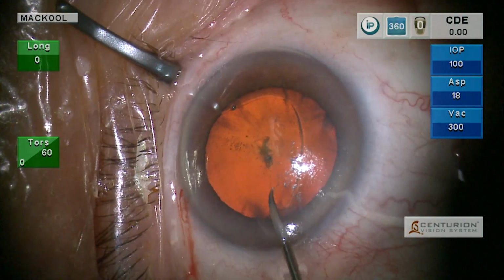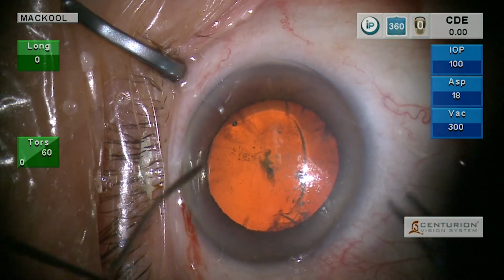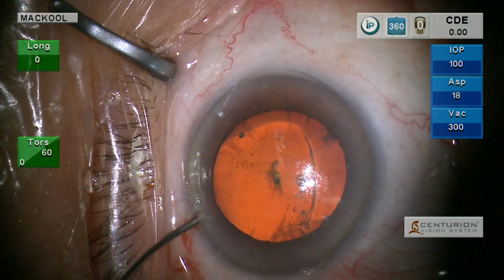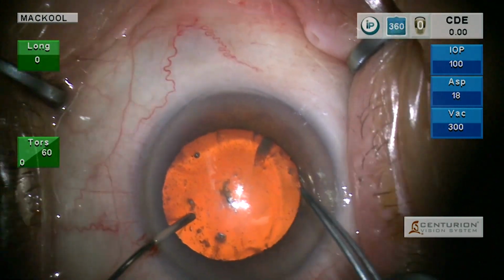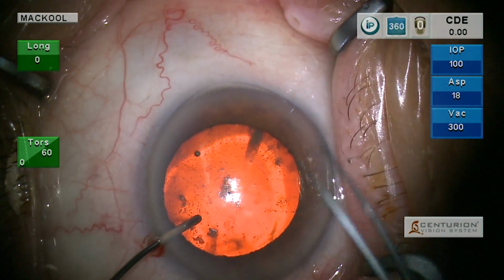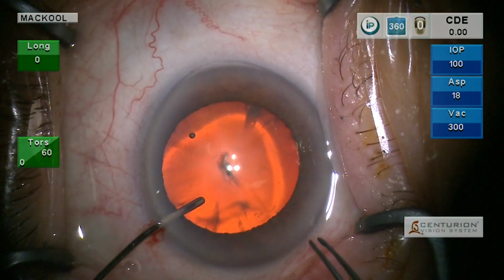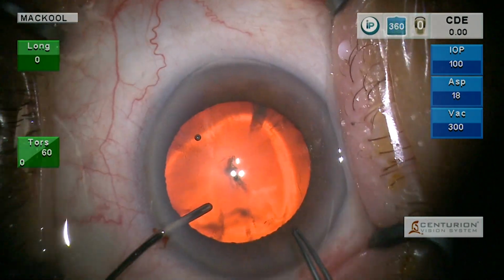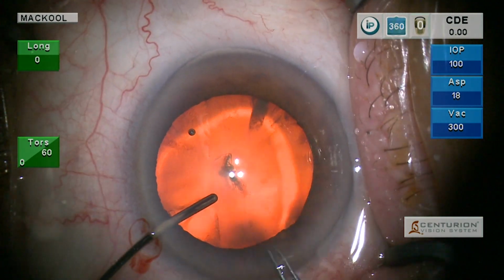So now I just injected a little bit of Provisc into the anterior chamber. Now the next thing here is capsulorhexis. I mean, you want to see great, right? But there we have some mucoid lid secretions, whatever. Irrigate nasal to temporal. So the technician irrigates and then good, we're done. So now we don't have that obstruction.